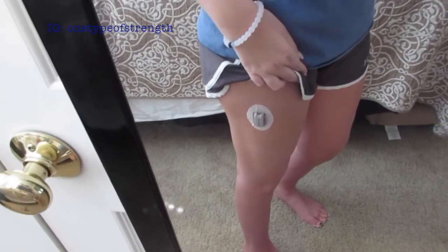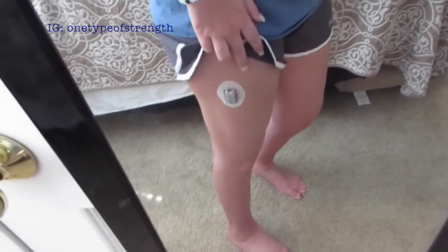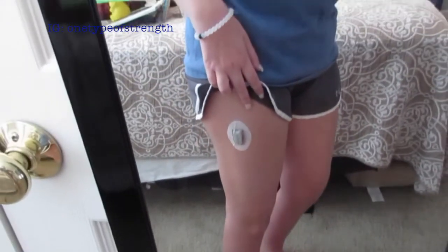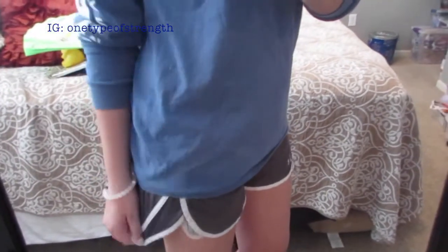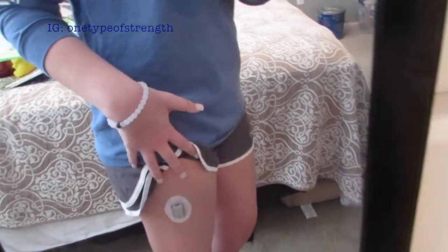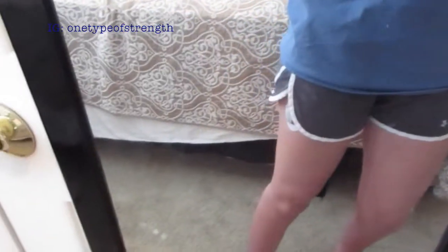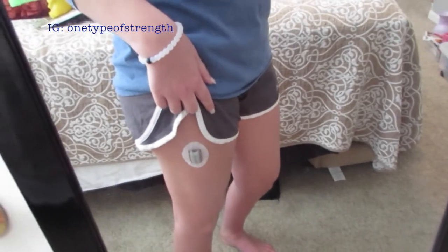Here in the mirror is a better look at the sensor on my upper thigh area. I love this spot — I get about three weeks out of this site, so that is my favorite. I can cover it up with pants, long shirts, and so on. It isn't really that big, and it's a really great spot to put your Dexcom if you're looking for a new site.